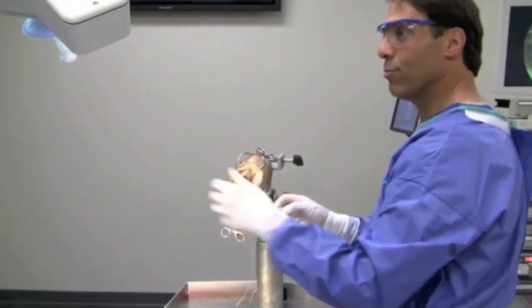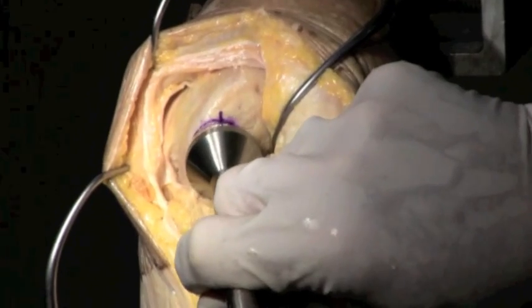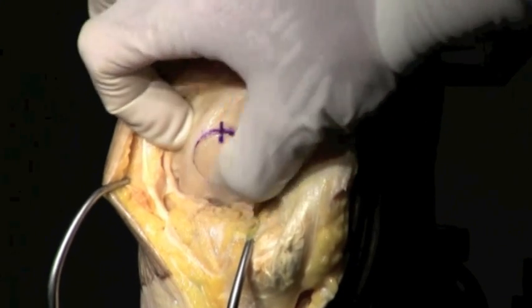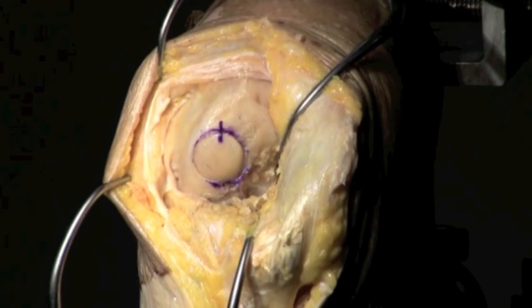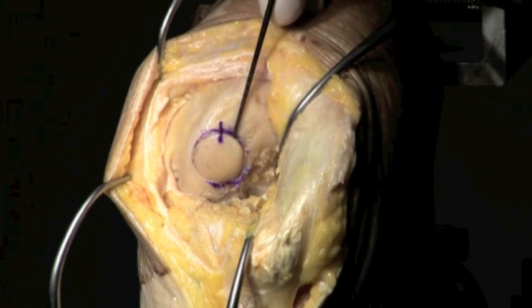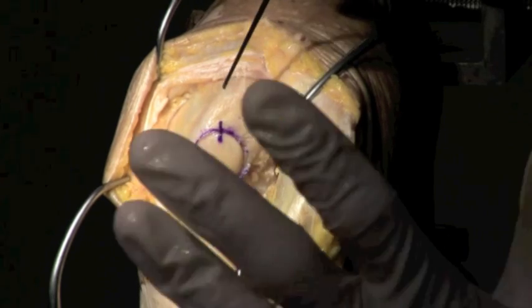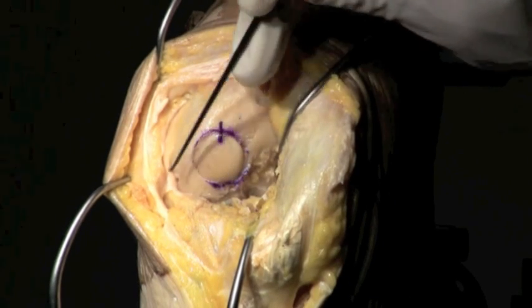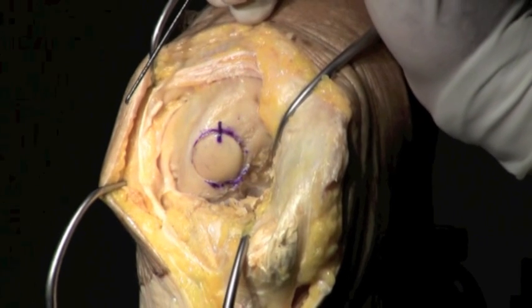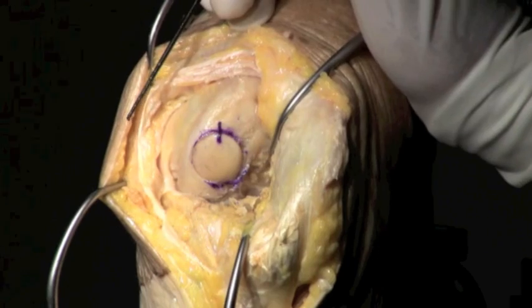All right, now the moment of truth here for us to put in our defect, real lightly, like that. And what you can see is this defect is really nicely filled in here. And I used the probe here to see there's a nice match right there. I chose a part of the graft that tapers into the corner right here because I knew that part of the condyle tapered in right there. So if it fits well, we don't have to use any screws or nuts or bolts or any other fixation devices. If it isn't fitting so well, we may have to augment it with something.